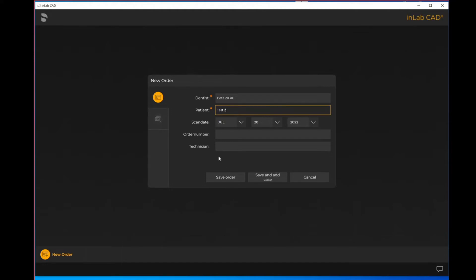If I were to select save order, that's simply going to save the patient's file, it will not let you start an actual case. So if you do want to immediately start that case, you want to hit save and add case as it will take you to the administration screen of the inLab system.